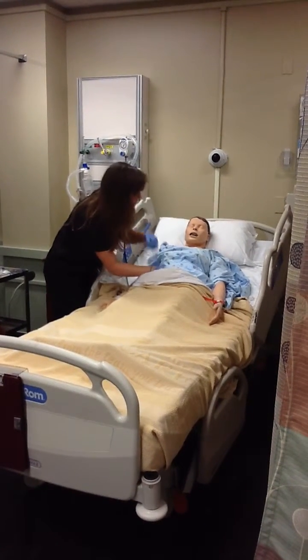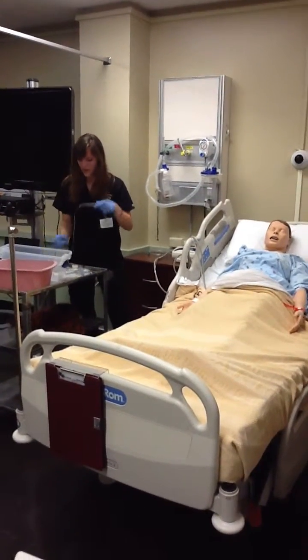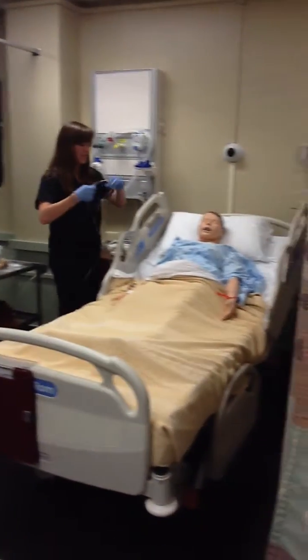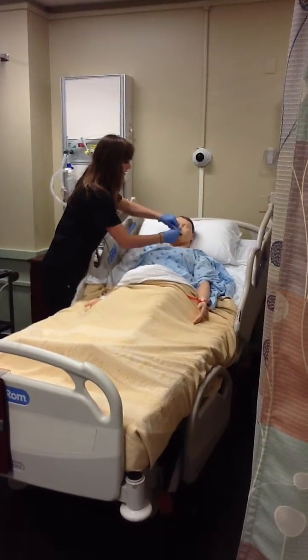Okay, and I hear them, so that means we can go ahead and continue on with the tube feeding. Now I'm just going to measure this out real quick, and when I place it in, I'm going to need you to tilt your head back.